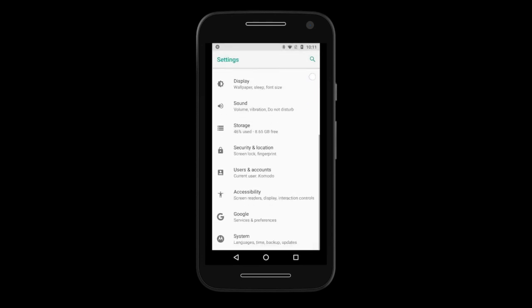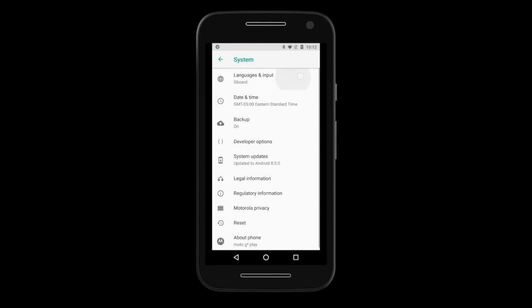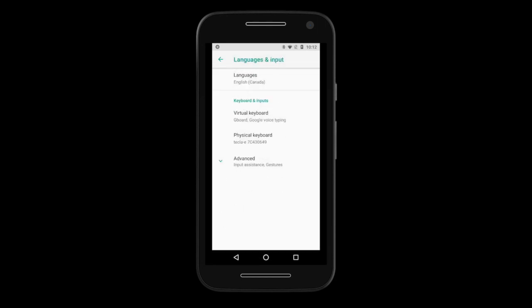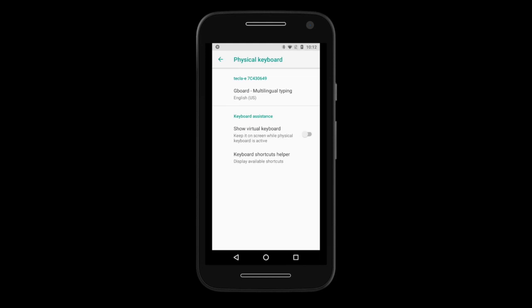Once the Tecla E is connected, go to Settings, System, Language Input, then Physical Keyboard. Make sure the Tecla E device has a layout assigned. We suggest English, US.